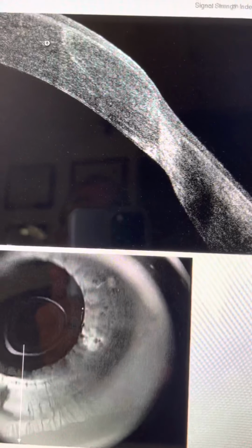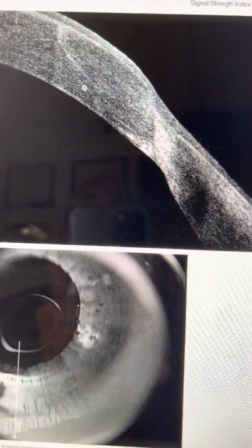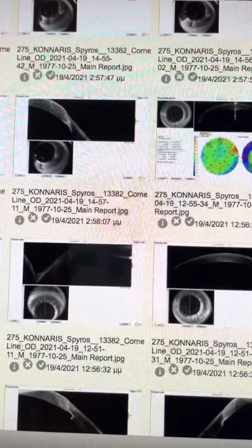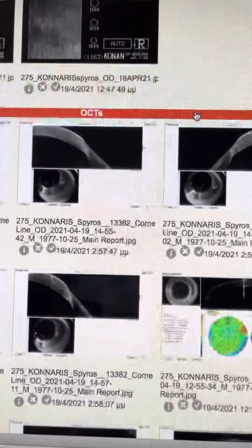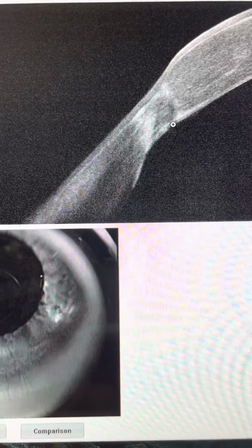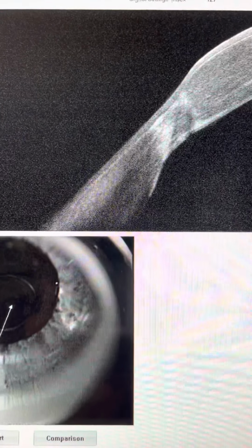You can also in this picture see the suture track of the original procedure. This is 20 years ago. Amazing technology, still keeps us amazed. Again, that right eye, this is the 6:30 to 7 o'clock position.